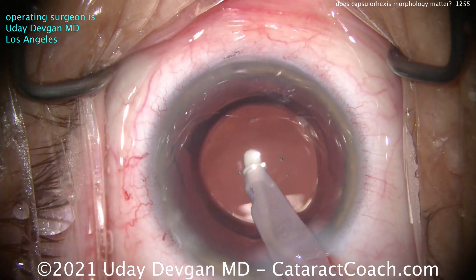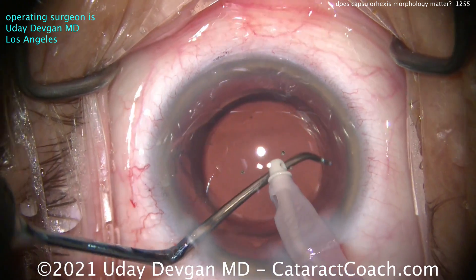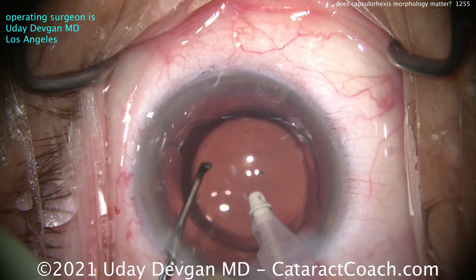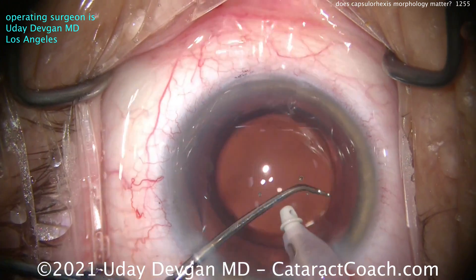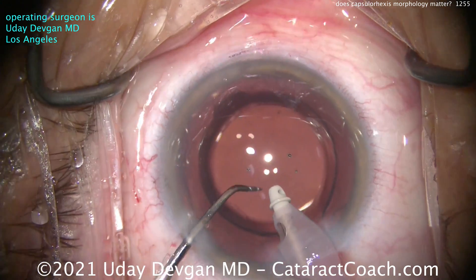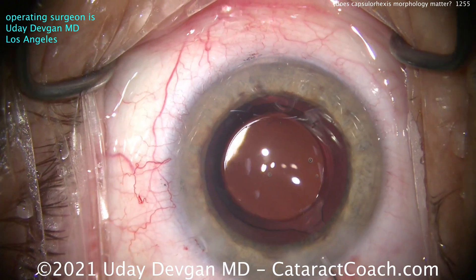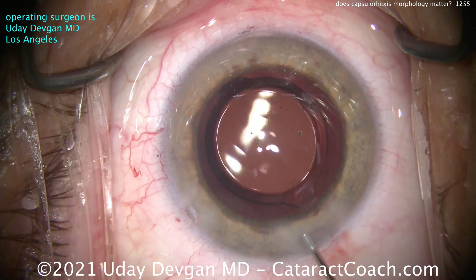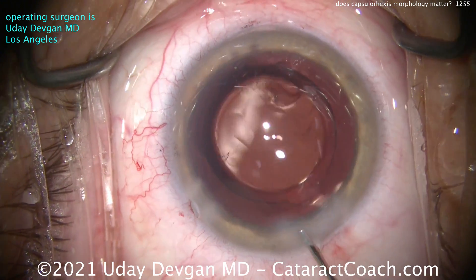If, however, you don't have that good overlap and you have one edge of the lens optic tilting forward or coming up at an angle, that may induce some aberrations like astigmatism or other things. So you've got to be careful about that. In most cases, you don't have to have a perfect rhexis — it is part of your signature, and I like it to be as perfect as possible. This patient certainly had a beautiful surgical outcome and 20/20 vision. But every time I look carefully at that rhexis edge, I think: if only I'd made that just a fraction of a millimeter larger in that one spot.